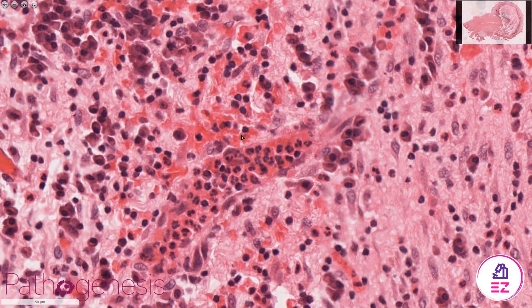Neutrophils you often see within vessels and also migrating through epithelia.